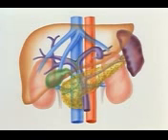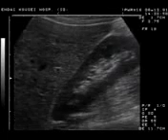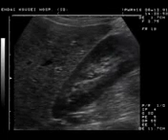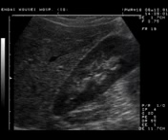Recently, the digestive tract, such as the stomach and the intestines, has also been successfully visualized. During the examination, we use this probe to view the internal structures of the human body. Place the probe on the skin's surface. Then we can see in real time a tomographic image covering a wide field from the skin surface to deep regions.